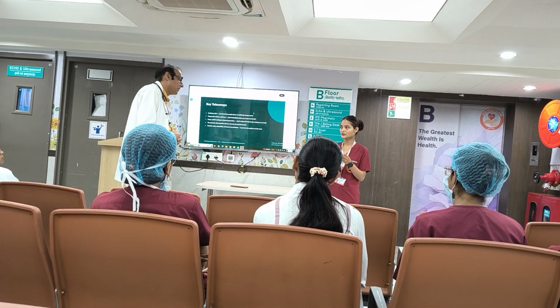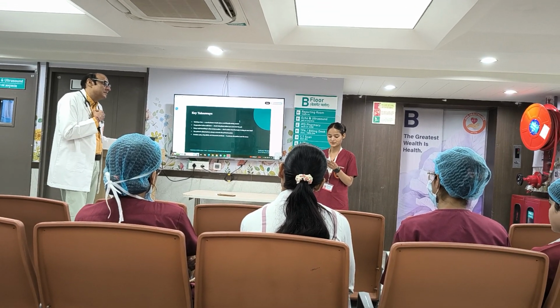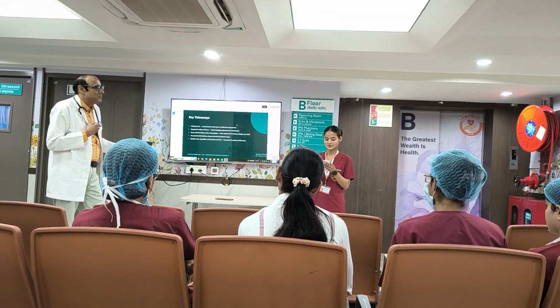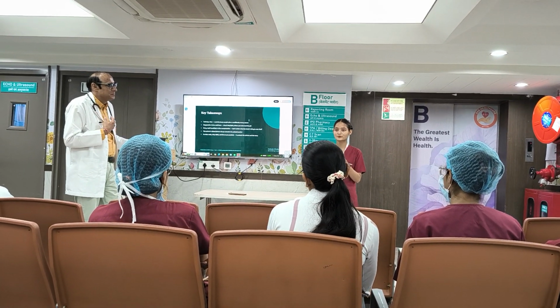Sample type is arterial. Okay. Arterial sample. Patient number 153. Patient ID is 20708. Components of the ABG: the pH is 7.38.